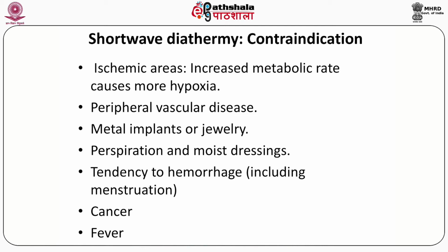In fact, during menstruation also, we should not use this shortwave diathermy, as menstruation is a condition in which there is active bleeding and also a tendency to hemorrhage, so we should not use the shortwave diathermy in those patients. In cancer patients also, shortwave diathermy should not be used. And in fever, although fever is a feature of inflammation, if the fever is profound, the shortwave diathermy cannot be used. It should be used only in case of pain and swelling.